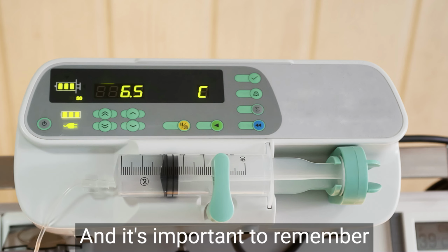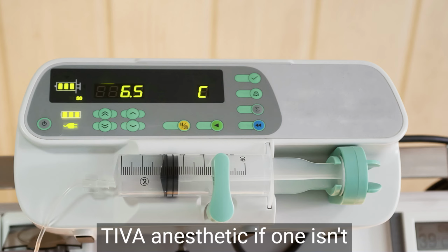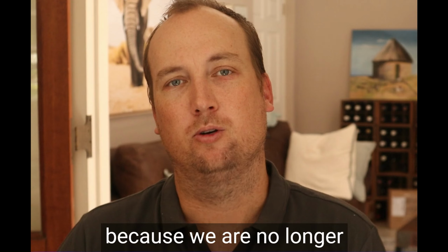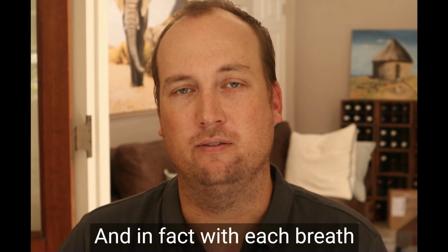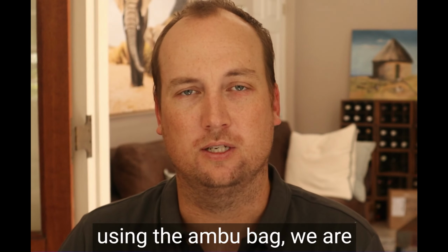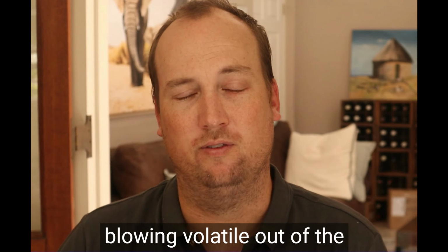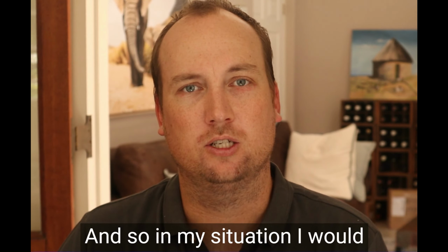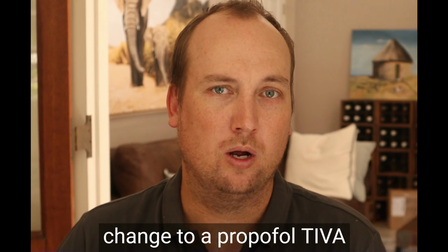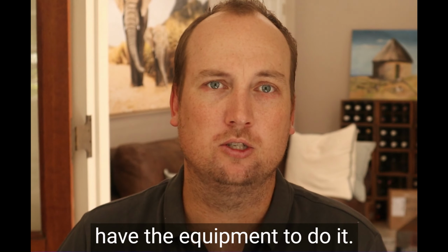It's important to remember in these situations that one will have to change to a TIVA anesthetic if one isn't already performing a TIVA, because we are no longer adding volatile to the system, and in fact with each breath using the AmbuBag we are blowing volatile out of the patient and out of the system. And so in my situation I would change to a propofol TIVA, as I can rapidly do this and I have the equipment to do it.